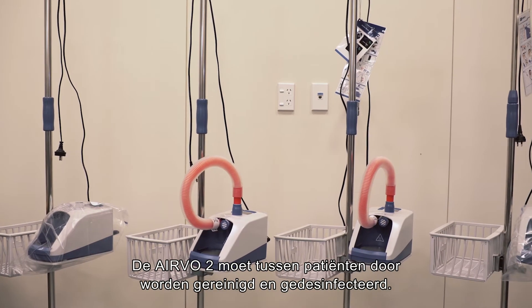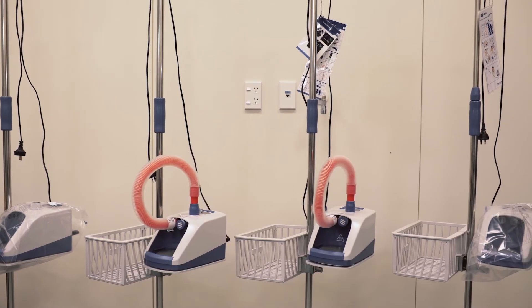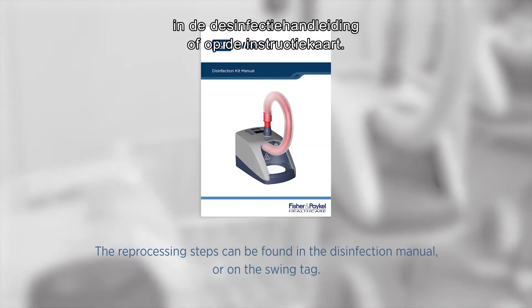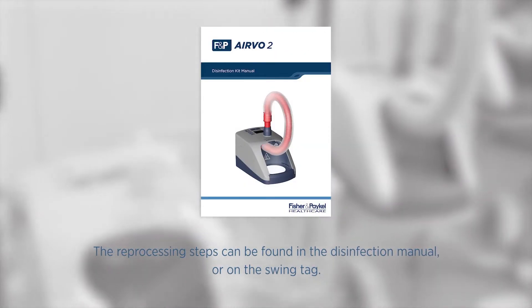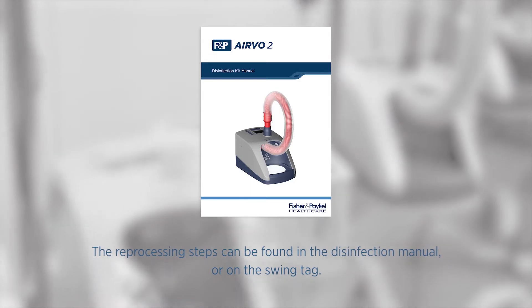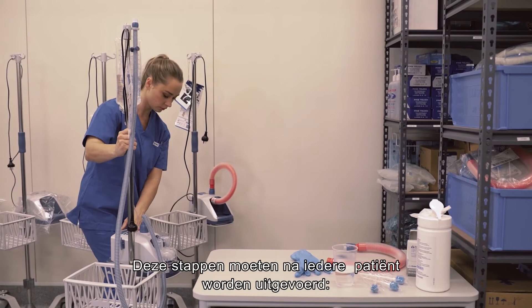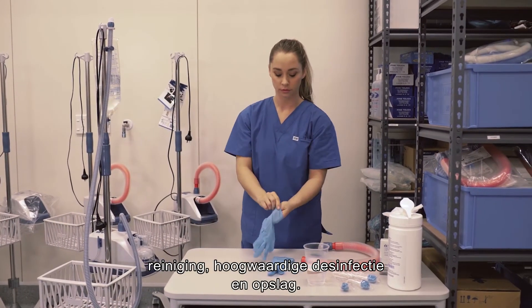The AIRVO 2 must be cleaned and disinfected between patients. This should take place as soon as possible after use. The reprocessing steps can be found in the disinfection manual or on the swing tag. These steps must be carried out between patients: cleaning, high-level disinfection and storage.